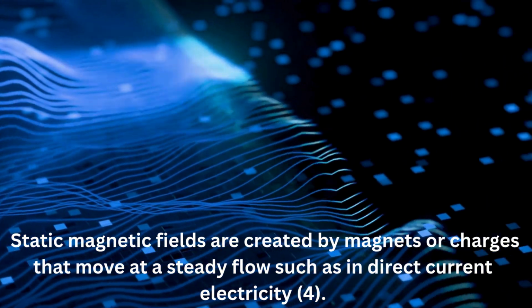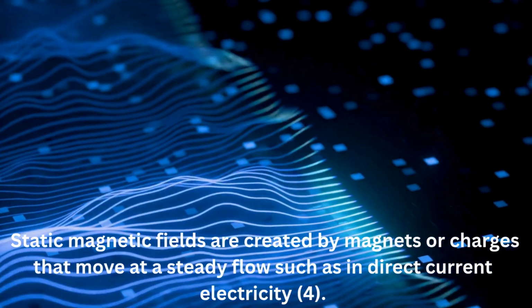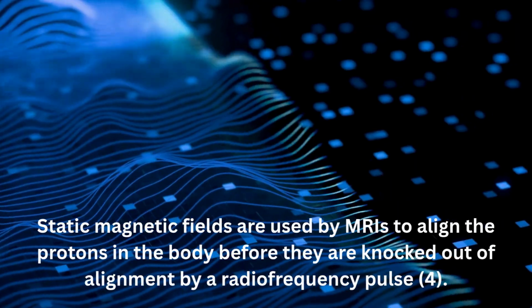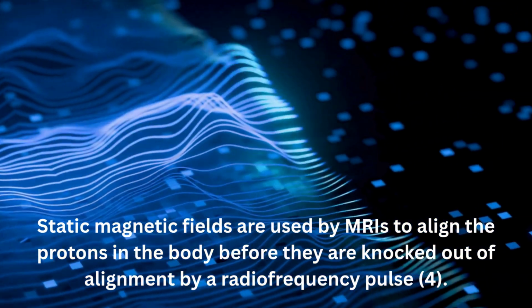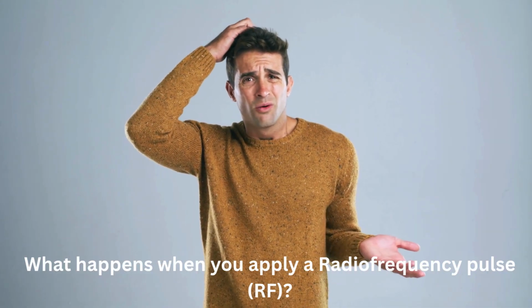Static magnetic fields are created by magnets or charges that move at a steady flow, such as in direct current electricity. Static magnetic fields are used by MRIs to align the protons in the body before they are knocked out of alignment by a radio frequency pulse. What happens when you apply a radio frequency pulse?